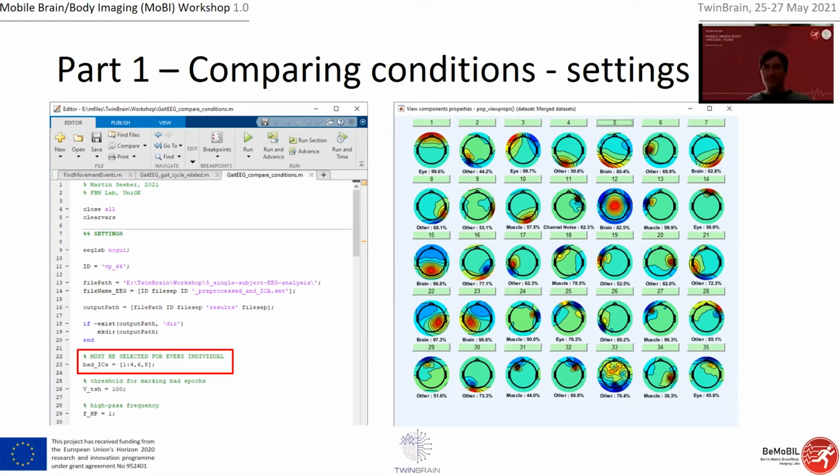Yeah, in terms of mathematical calculation, what I understood is that, based on that, there is always this component in the center of the head that needs to be removed. Well, I would not necessarily agree, because it could be physiological activity, and that's exactly why I don't. A good example related to your example: if you have two dipoles in the auditory cortex, that sums up also to a central prefrontal one. So we have to interpret the topography with great care.